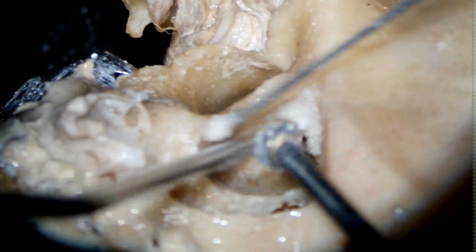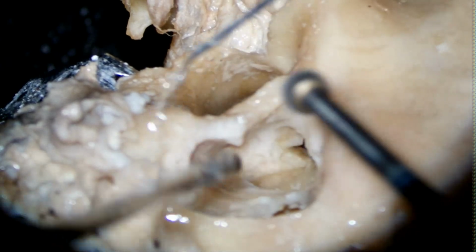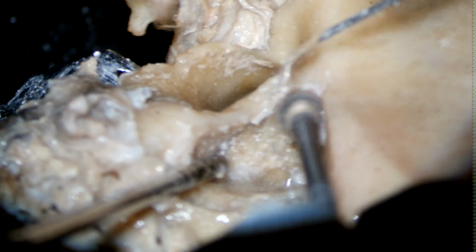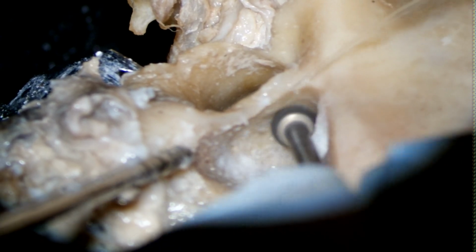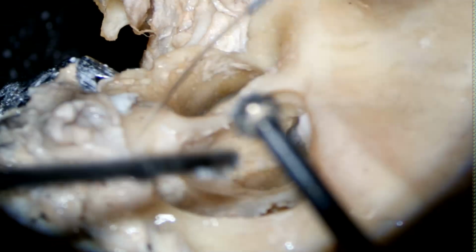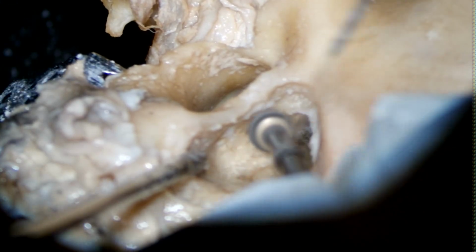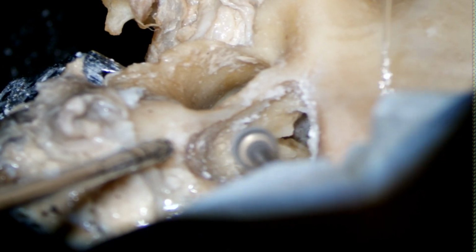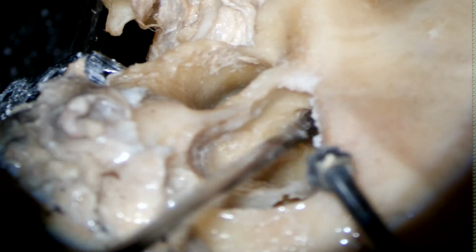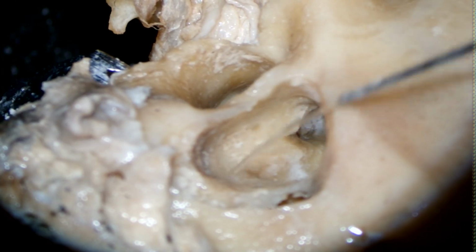Water. Pour water. Okay, give me a smaller size burr.